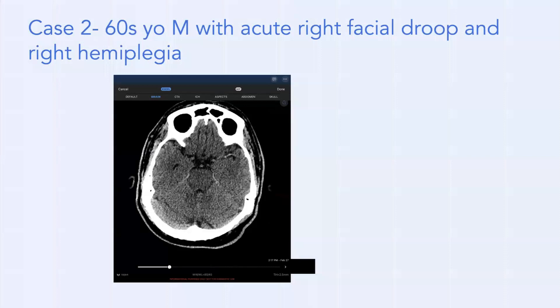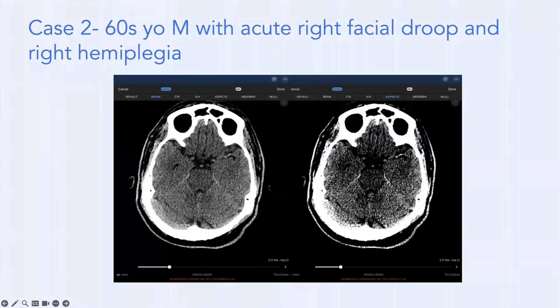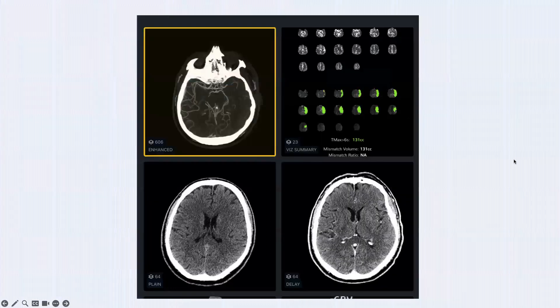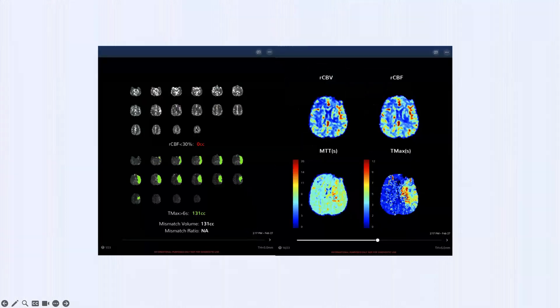Case 2: Patient in their 60s with acute right-sided facial droop and right-sided hemiplegia. On the app, a subtle hyperdense clot is visible in the left MCA. ASPECTS appears 10 with excellent gray-white differentiation and well-seen deep nuclei. The LVO alert appears — a yellow icon/border pointing to the left MCA level. CT perfusion: zero core infarct but 131 cc's of acute ischemic tissue — excellent volume to go after. The mismatch ratio can't be calculated because a number over zero is not real.